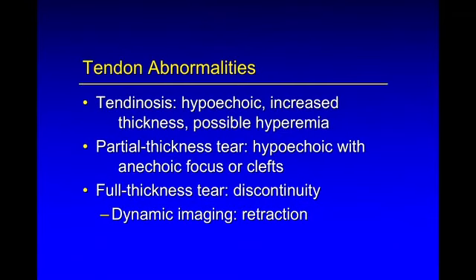Looking at tendon abnormalities, I tend to put this into three categories: tendinosis, partial thickness tear, and full thickness tear. For tendinosis, the tendon will be abnormally hypoechoic, usually increased in thickness, with possible hyperemia. Partial thickness tears, typically coexisting with tendinosis, will have the appearance of tendinosis with the added feature of an anechoic cleft or focus. A full thickness tendon tear is characterized by discontinuity, where dynamic imaging is helpful to show tendon retraction indicating a full thickness tear. Of note, tendinitis is not in the vocabulary here, because it has been shown in every tendon in the body that after about day 7 to 10 after an injury, the true inflammatory phase is gone. So by the time they come to imaging, there is no inflammation present. If there is hyperemia, this has been shown to represent neovascularity and not inflammation.